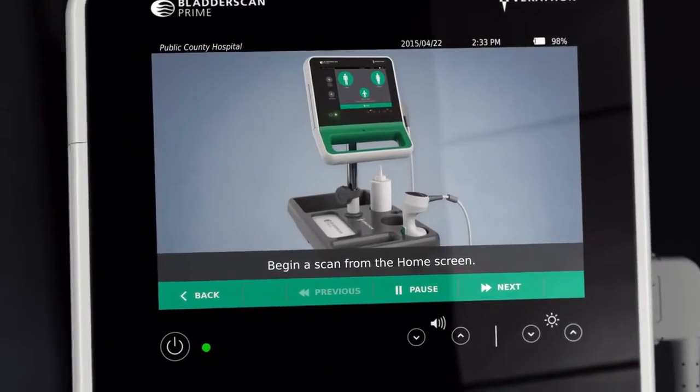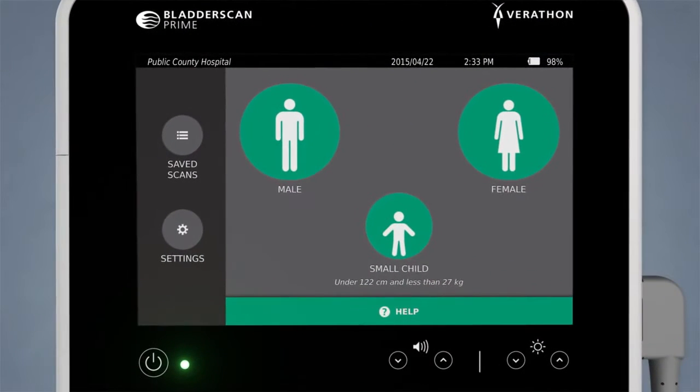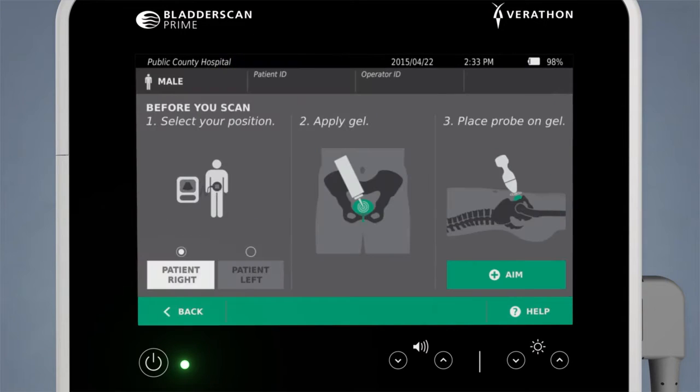No sonographer required. Begin a scan from the home screen. Select the proper patient-specific mode using the touchscreen: male, female, or small child.